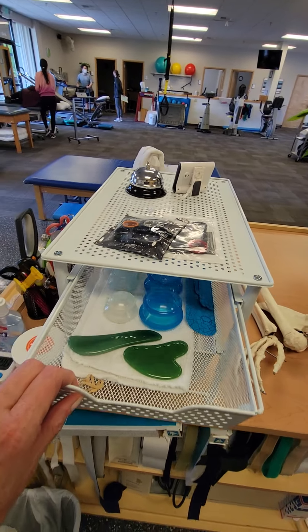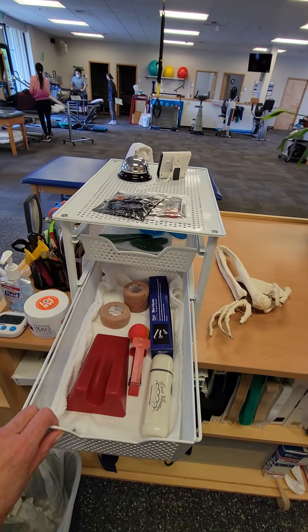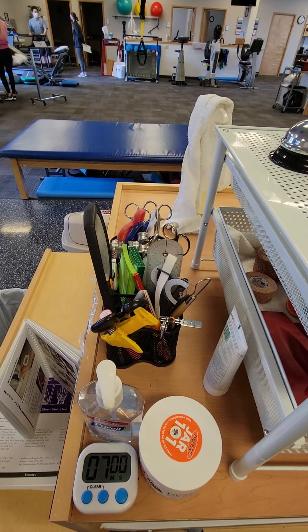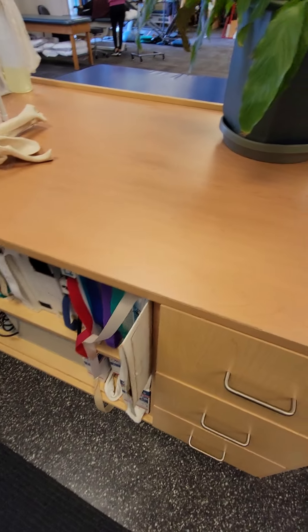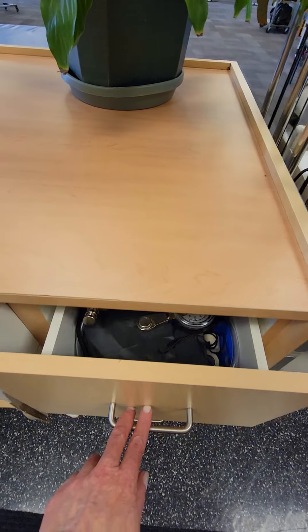Most of the tools I like to use — as far as cups and scraper tools, vibration, a little bit of tape and Coban — all of your measuring goniometers will be there. Splinting supplies, and by the way, most of what you see is still here from when you were here last. Dynamometer and pinch meter here.